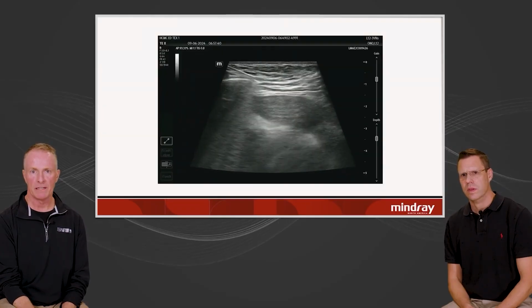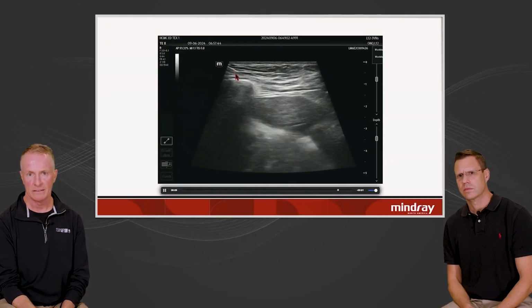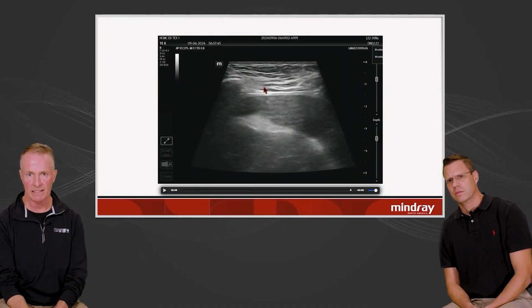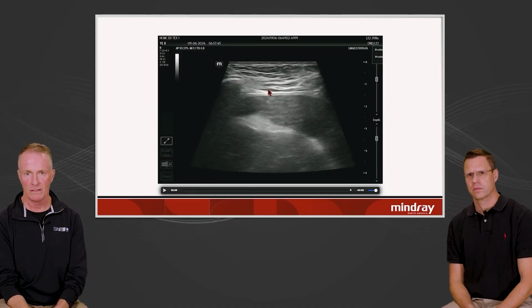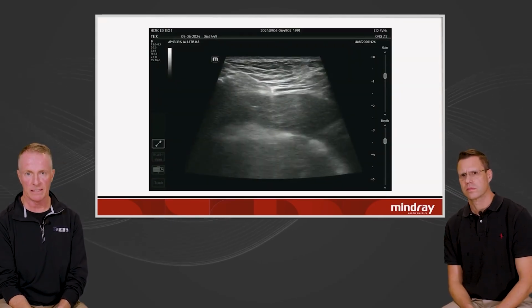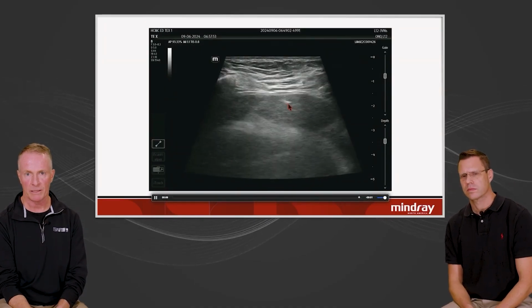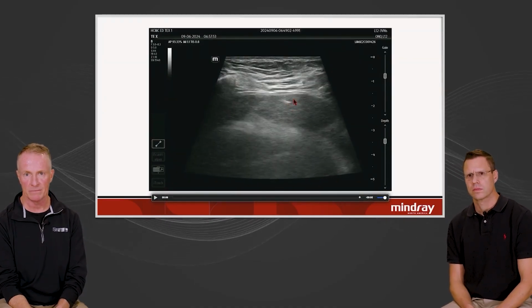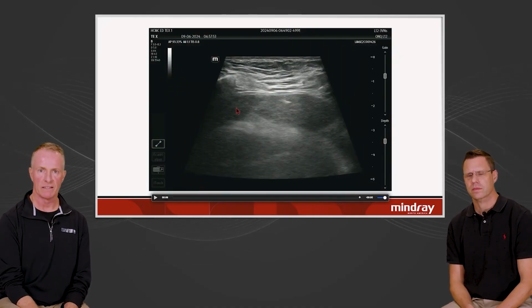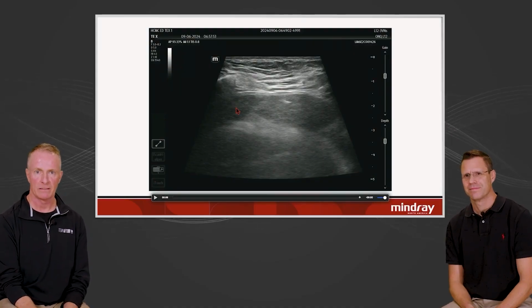So here's an example. You can see the needle coming down clearly right there. This is actually a rib, not the sternum, because we're out more lateral. But you see the needle came in like this, and it's right here. You can see where the tip is in the next view. There's the tip. Tip just punctured the pericardium. There's the bevel on the tip. Very clear. This is a resident doing this who's never done it before, and it's still pretty crystal clear where you are.